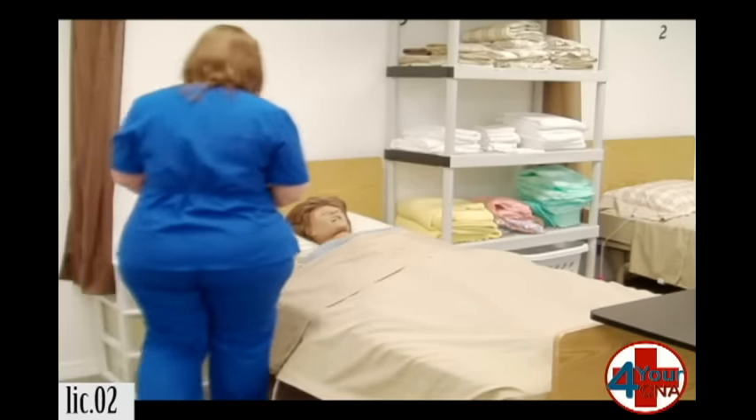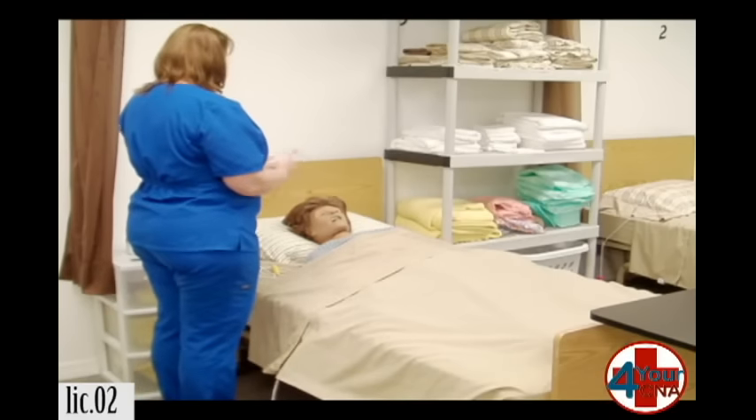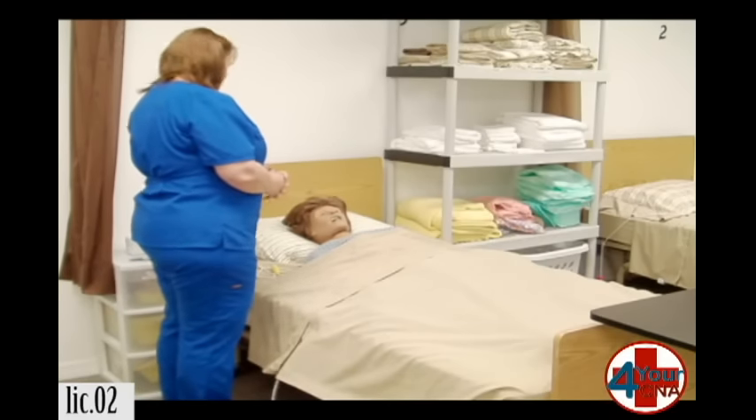Hi, Ms. Jones. My name is Patty. I'm your CNA today. How are you? Great. I need to clean your catheter. Is that okay?